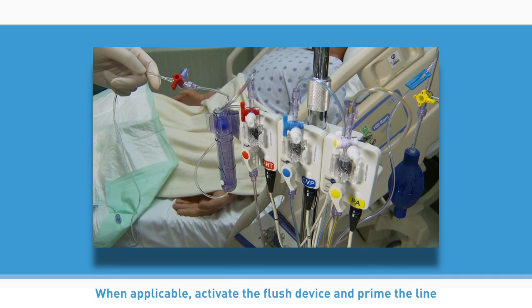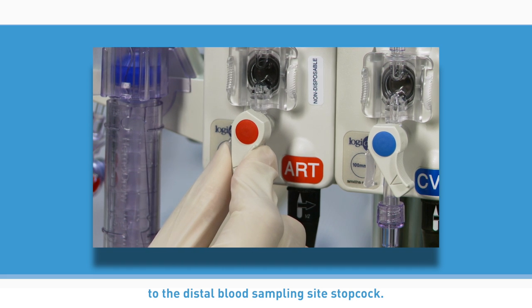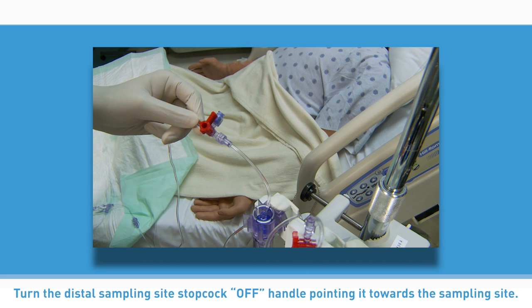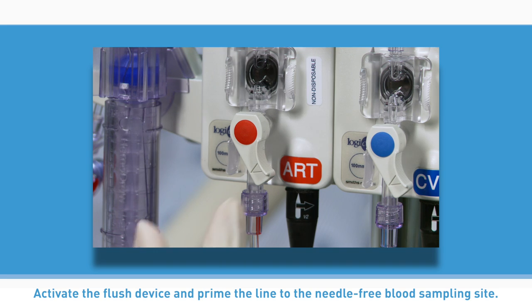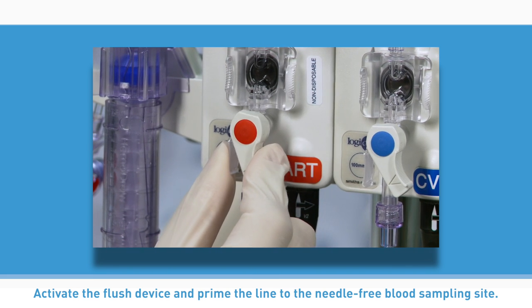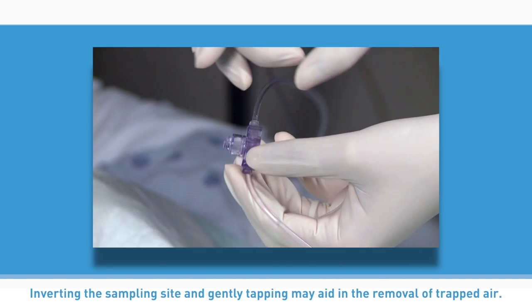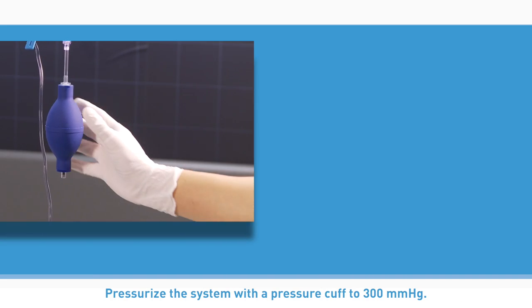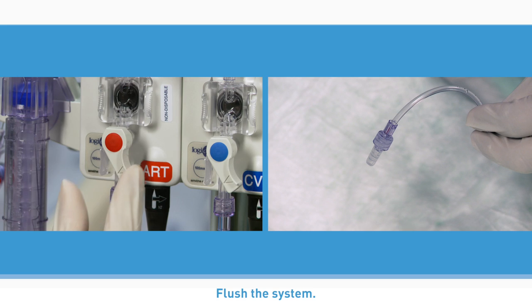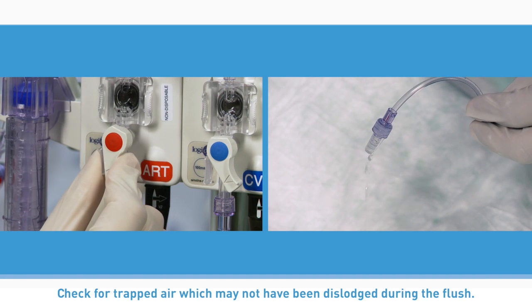When applicable, activate the flush device and prime the line to the distal blood sampling site stopcock. Turn the distal sampling site stopcock off, with the handle pointing toward the sampling site. Activate the flush device and prime the line to the needle-free blood sampling site. Inverting the sampling site and gently tapping may aid in the removal of trapped air. Pressurize the system with a pressure cup to 300 millimeters of mercury. Flush the system and check for any trapped air not dislodged during the flush.